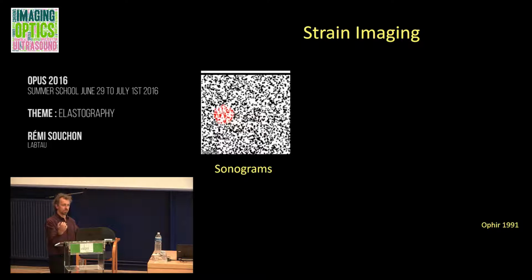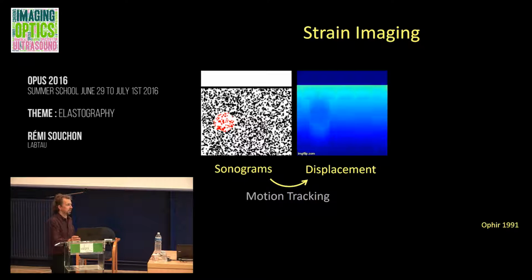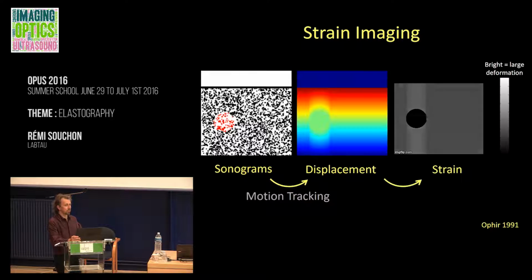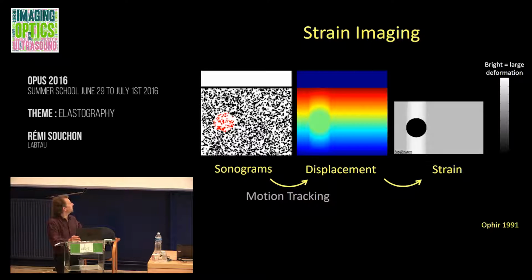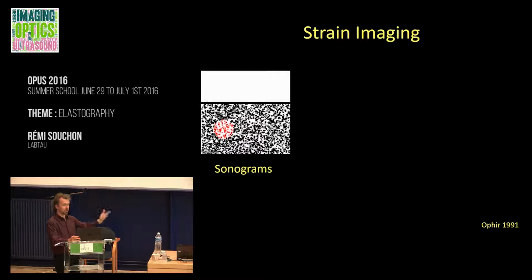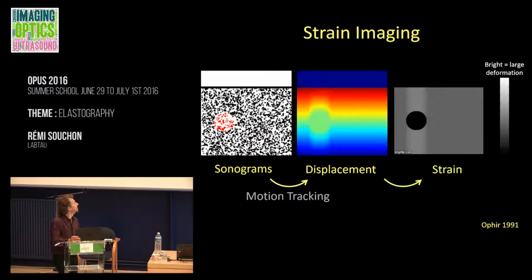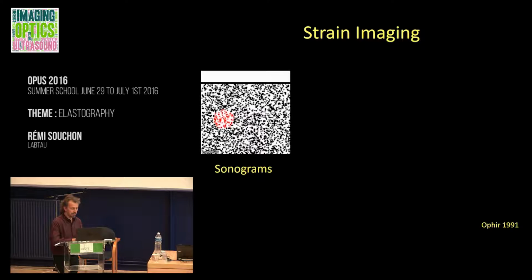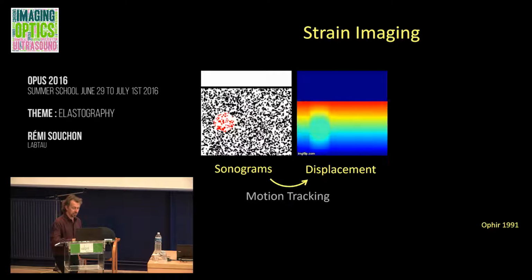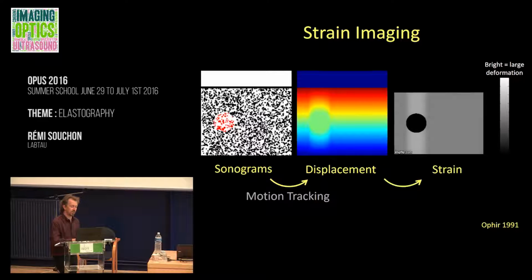But if you move just a slightly bit, and we're talking about just percent deformation, just a fraction of millimeter, you don't have to squeeze hard, then you get these images, and you see that they're dynamic, actually showing that the strain at some instant is more or less pronounced or more or less intense, and you actually get to see not only the inclusion here, but also you can get some artifacts such as stress concentration that you see. You see this white area here.